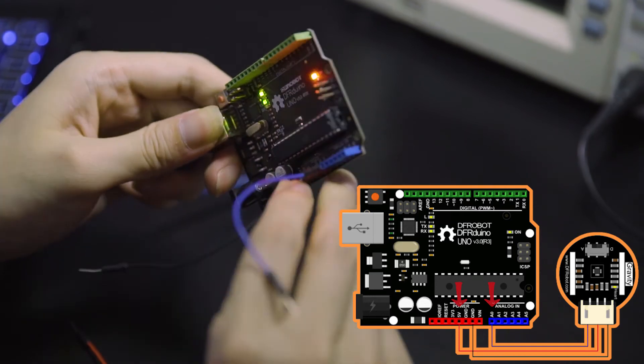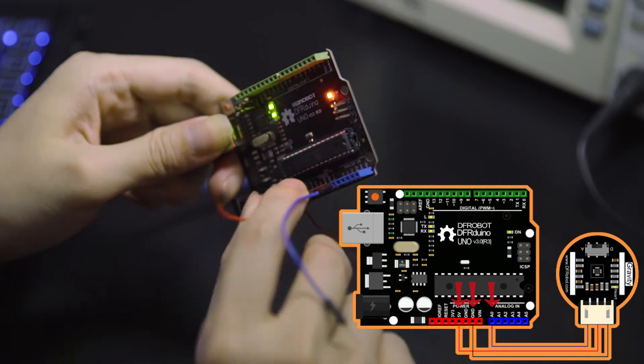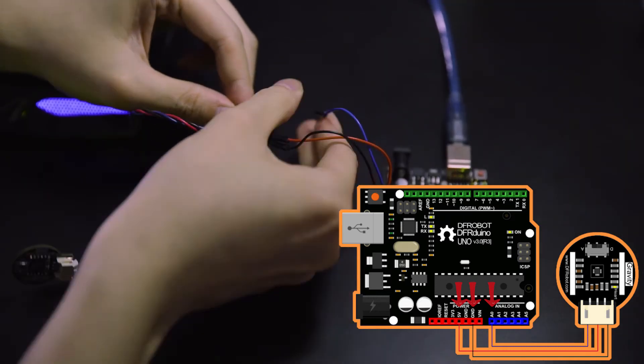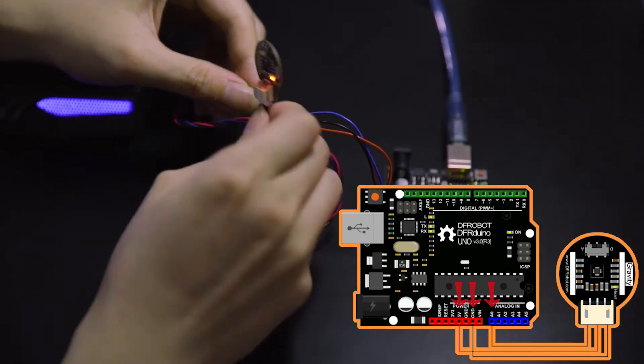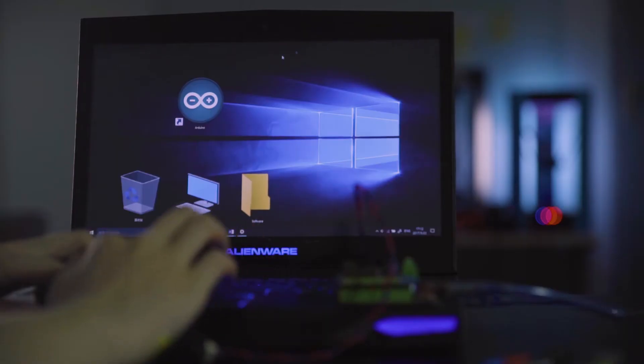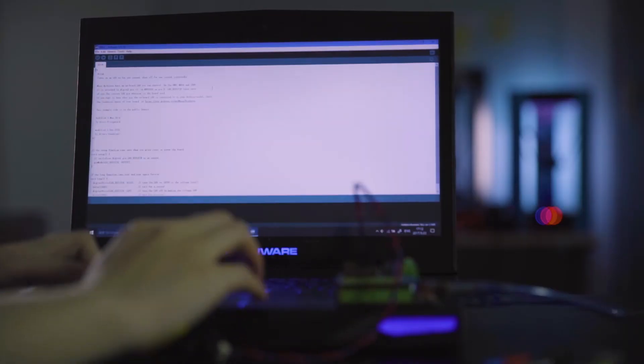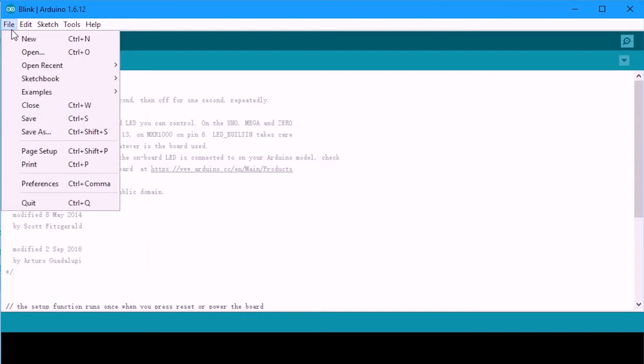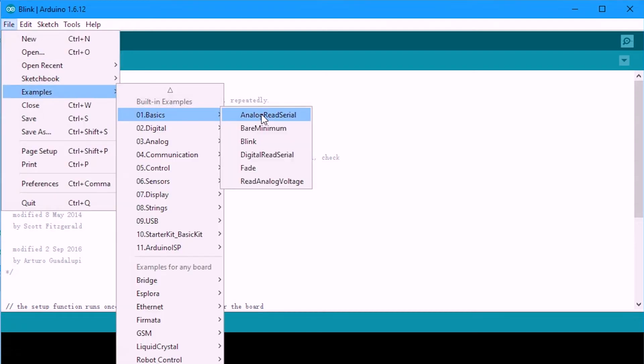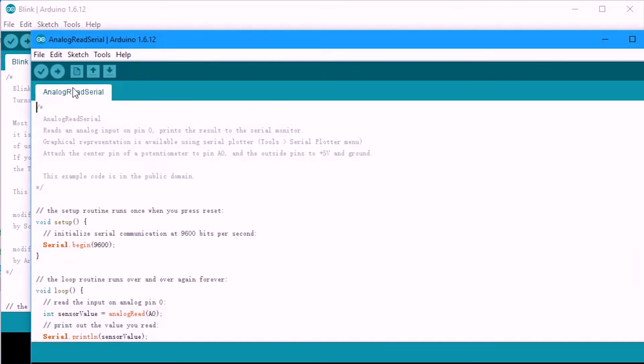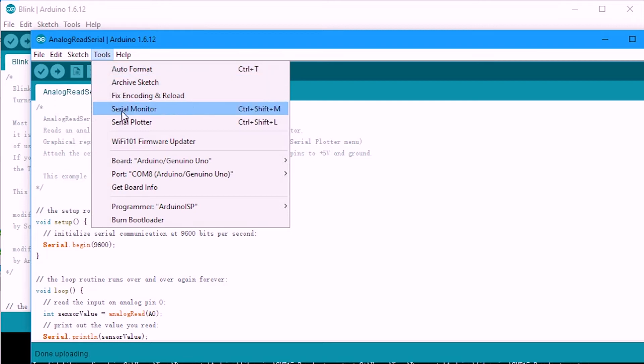Open IDE, select the right board type and COM port, then go to Example, Analog, and open AnalogInOutSerial. Upload the code to Arduino board.